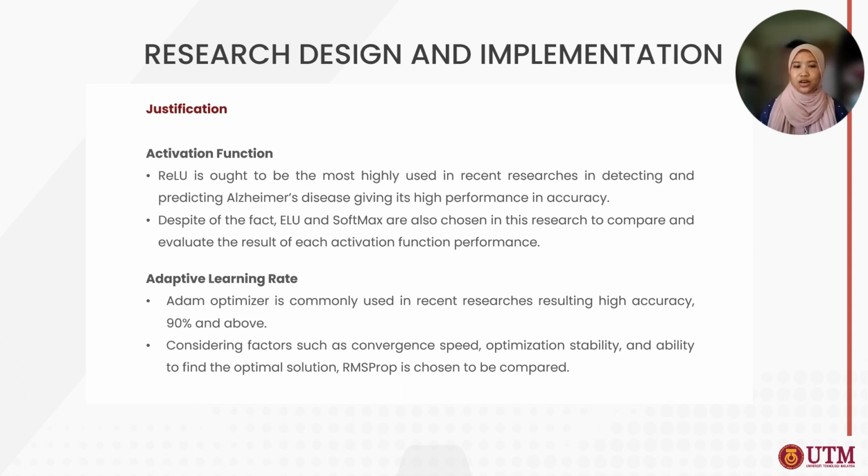The justification for the chosen activation functions is that ReLU is thought to be the most highly used in recent research in detecting and predicting Alzheimer's disease, given its high performance in accuracy. Despite that, ELU and SoftMax are also chosen in this research to compare and evaluate the performance of each activation function. For adaptive learning rate, the Adam optimizer is commonly used in recent research, resulting in high accuracy of 90% and above. Considering factors such as convergence speed, optimization stability, and ability to find the optimal solution, RMSProp is chosen to be compared.